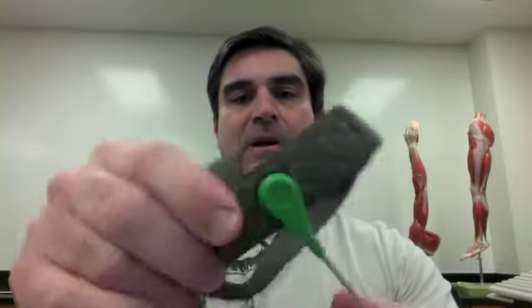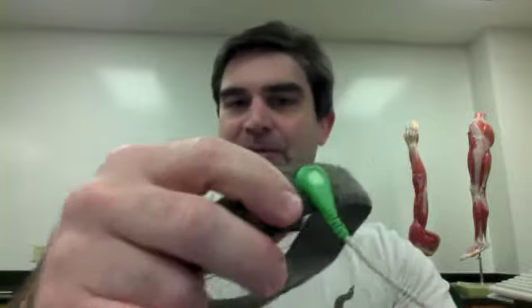When we're talking about the ground, what we're going to clip in is a little strap. You're going to be able to take this, and we'll put a little gel, and you'll be able to clip that on, and you're going to wrap this like so, and put that around your ankle. If you happen to have large calves, if you've got a muscular calf, that might be a problem, so you've got to pick somebody scrawny in your group.